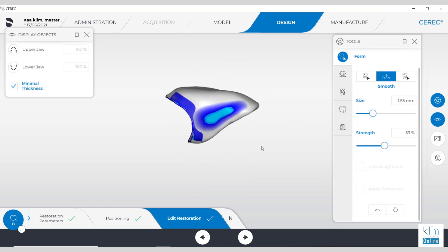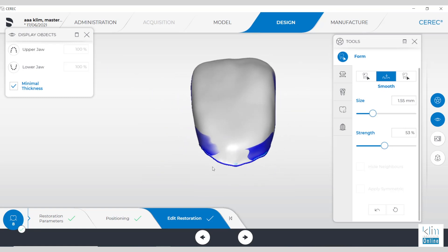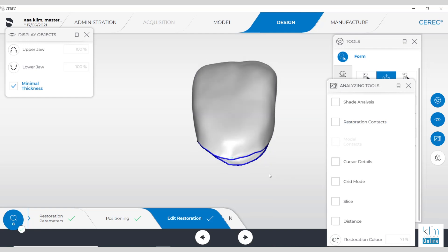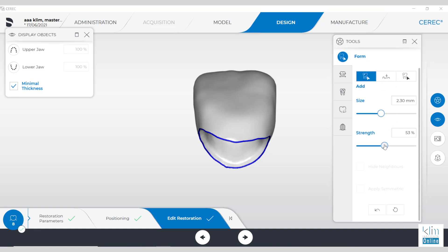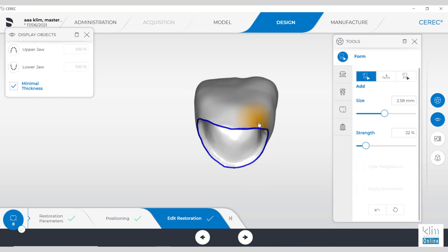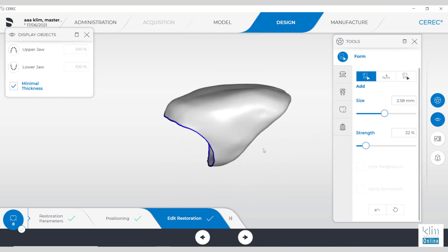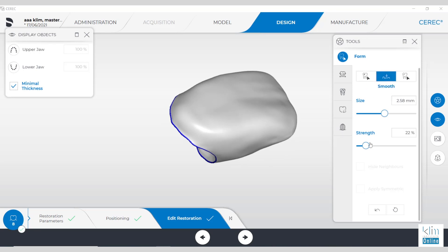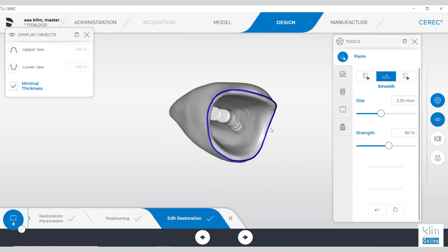The last step before we mill is to work on those cervical margins, particularly on the labial. I see this often in the software — it's slightly concave. The way around that is to use the smooth tool from the cervical angle at 50%. You smooth it first, and then add back from the cervical margin. That's how we correct that under-emerging contour. Now it's over-emerged — easy to fix. Go back to the smooth tool around 50% and smooth that angle, and now we have the emergence we desire for the case.